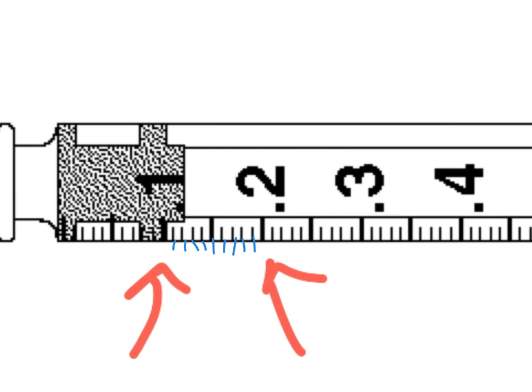So what that means is, here would be 0.1. If I needed you to administer 0.11, that would be that first line right behind the 0.1. The next one would be 0.12, 0.13, 0.14, and so on. Obviously, halfway would then be 0.15, because it's 0.15 instead of 1.5. Again, these are already small, so it's like we've moved the decimal just to the front instead. It's a way to kind of look at it very similar to our other syringe.